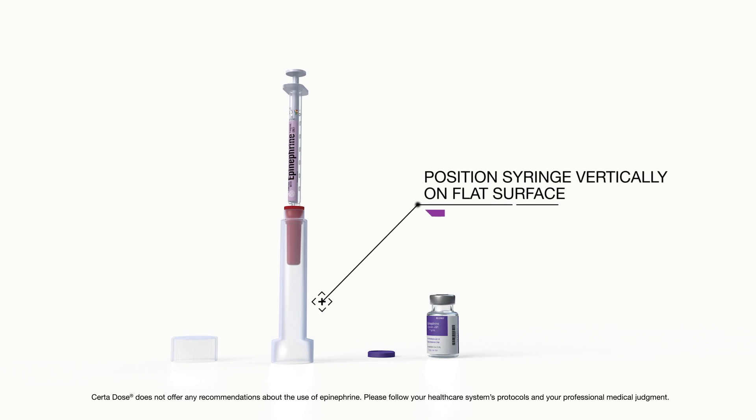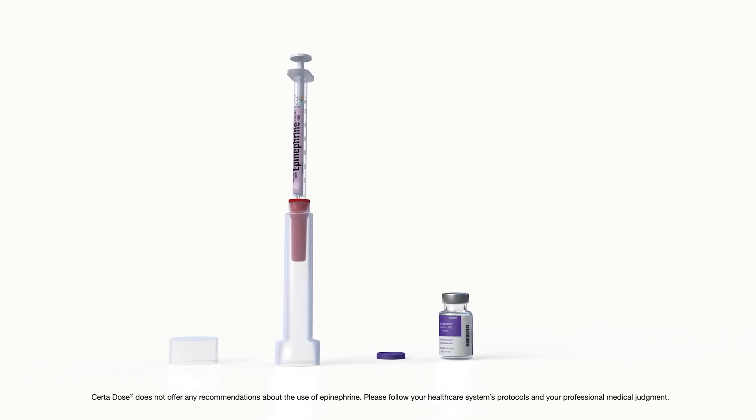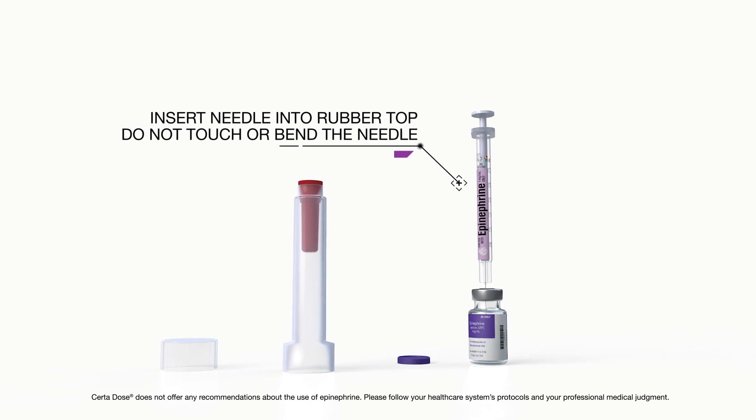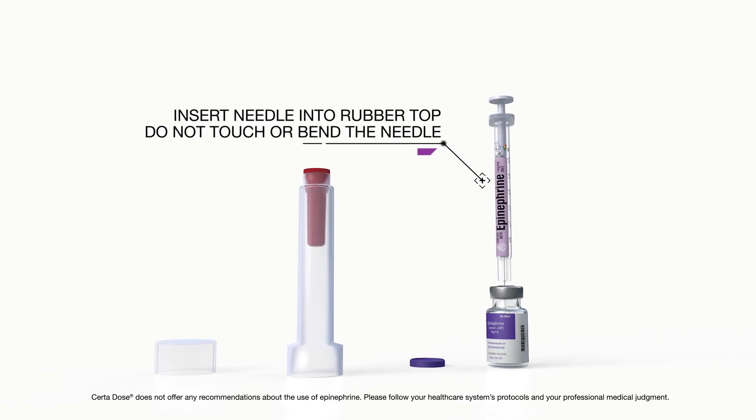Position the syringe vertically on a flat surface. Insert the needle into the rubber top. Do not touch or bend the needle.